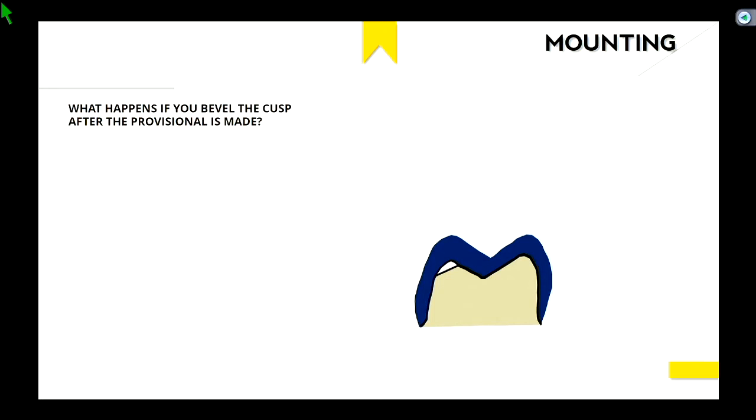Okay? So think about all the steps that you have in your fabrication process. What if you get a bubble in your wax up? What if you get a bubble in your impression material? What if you get a bubble in your investment? All these questions, yes?